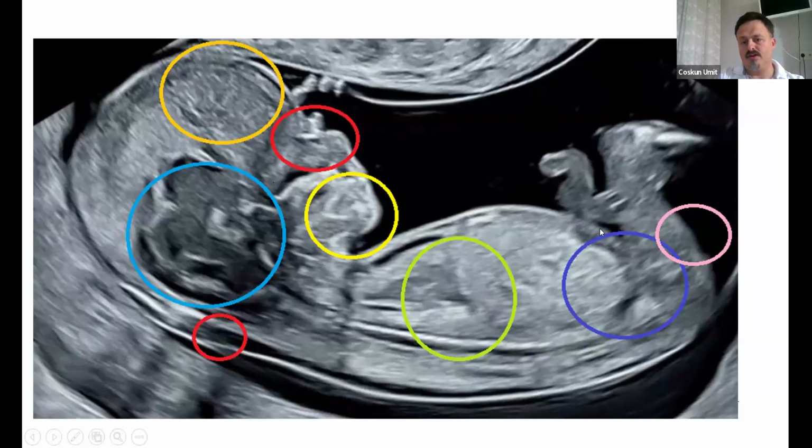This part is very important. Here is the diaphragm for the congenital diaphragmatic hernia, and the bladder, checking for megacystis, and fetal genitalia. Sometimes we can check it from the mid-sagittal plane. We will talk about the normal and the abnormal one by one.